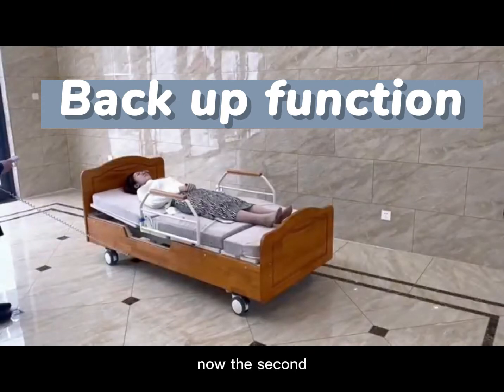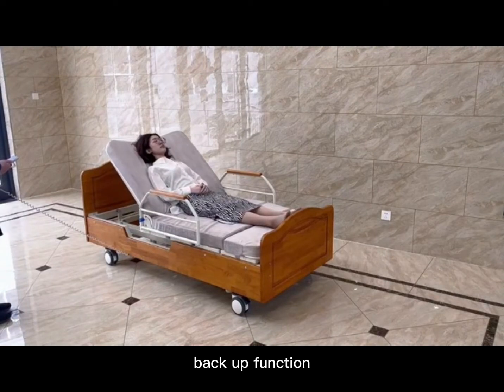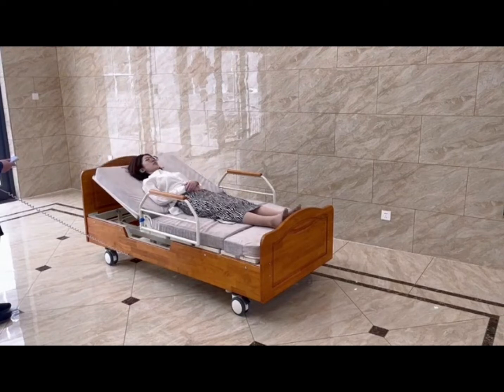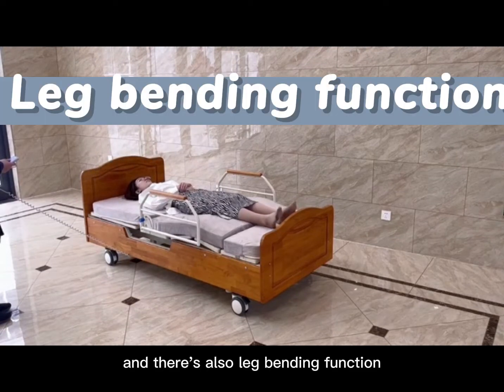And now the second model. Backup function. And there's also a leg bending function.